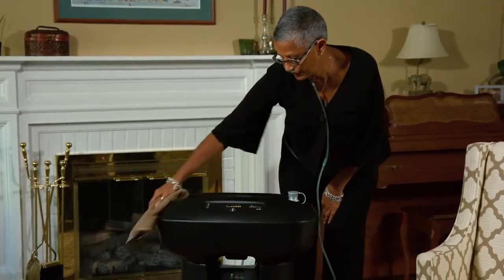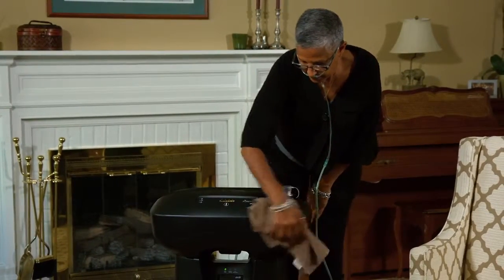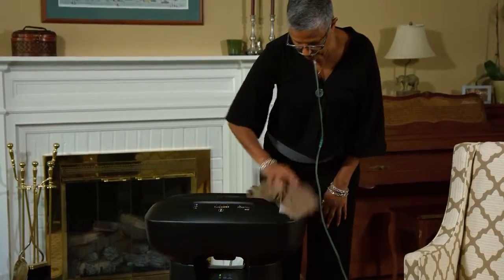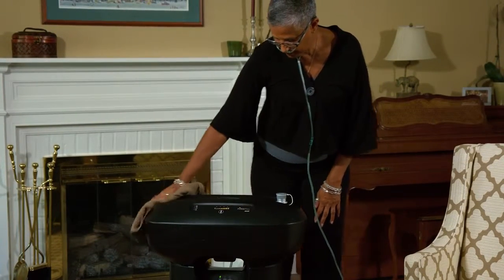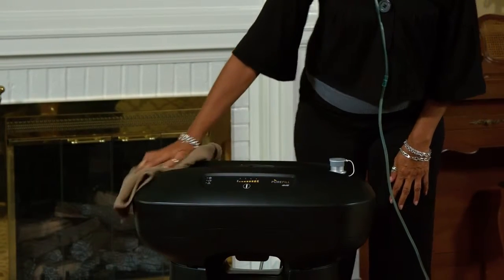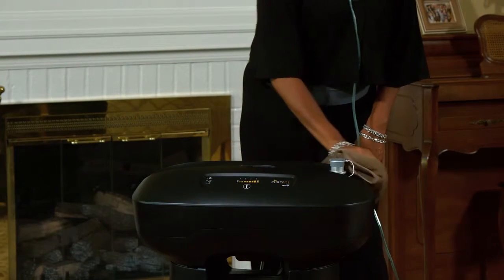Periodically wipe down the outside of the PureFill with a solution of hot water and mild detergent. If you decide to use a medical grade cleaning solution, follow the manufacturer's directions. It's important to keep a clean and safe environment for you and your loved ones.